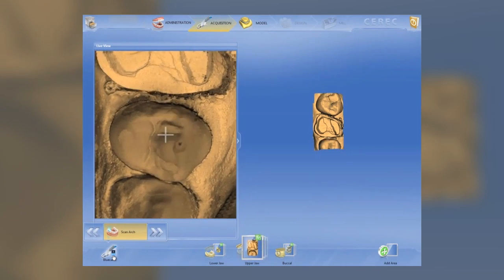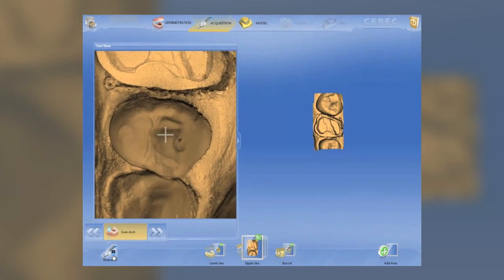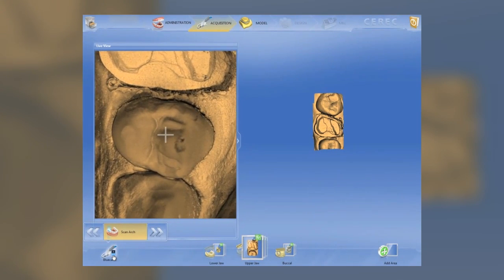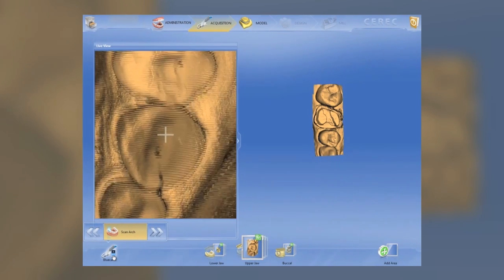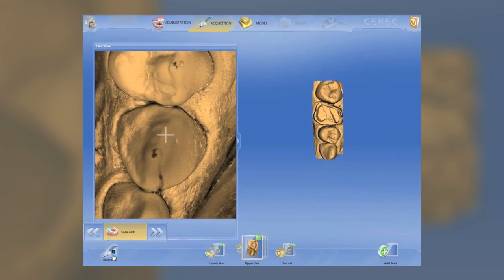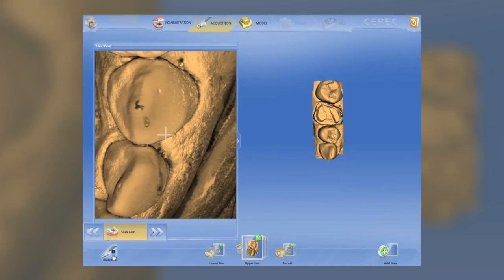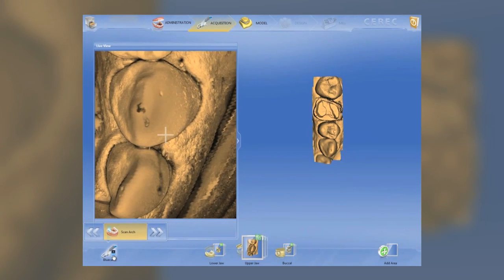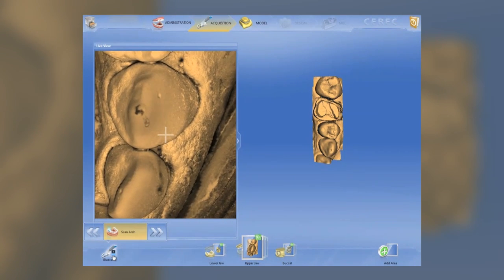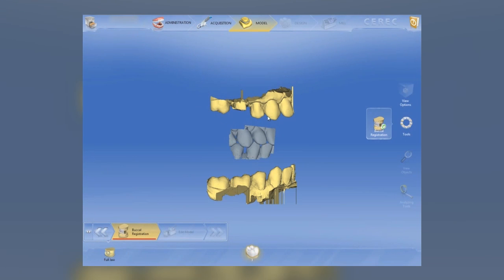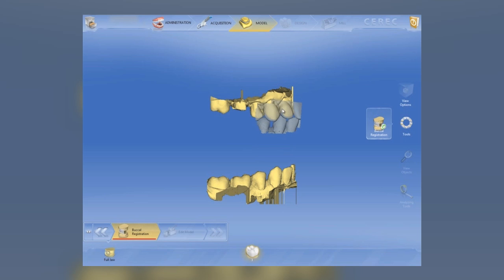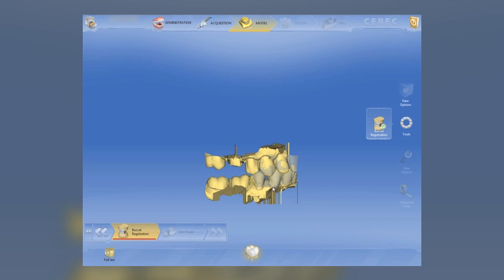As we move forward and get to the canine and premolar area, I'm going to roll the camera a little bit to the facial to capture more information to aid with the stitching. Once we capture those, we click on the model tab and we get to the buccal bite stitching step, which is almost self-explanatory. You relate the buccal bite to one arch and then transfer the whole complex to the other. You can verify that these have stitched together properly.